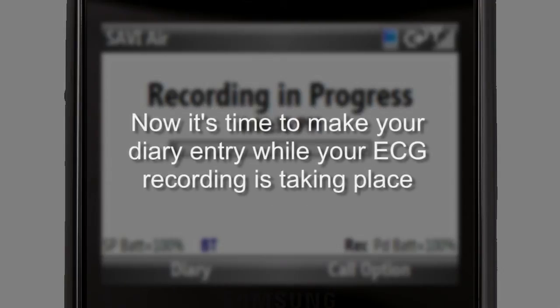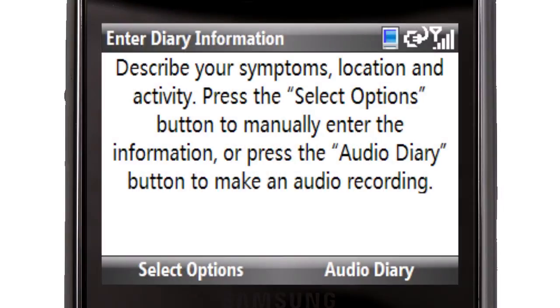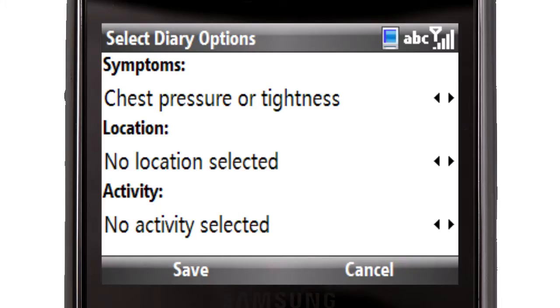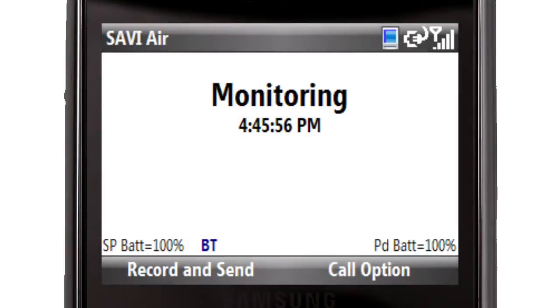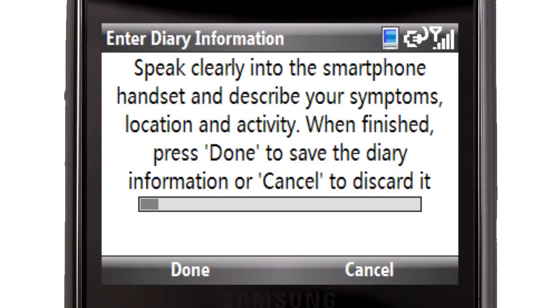Now it's time to make your diary entry. While your ECG recording is taking place, you can input a description of your symptoms into the smartphone's diary. After initiating the recording of a symptom, select Diary with the left soft key. Press the left soft key again to choose Select Options. Using the arrow keys, you can select from the list of symptoms. Once you have identified your symptom, press the Select button. Repeat the same steps to choose your location and activity. Then select Save with the left soft key to return to the monitoring display. You also have the option to make a voice recording as your diary entry. Select Diary with the left soft key, then select Audio Diary with the right soft key and follow the directions on the screen.